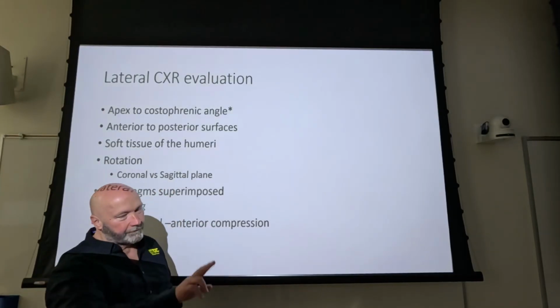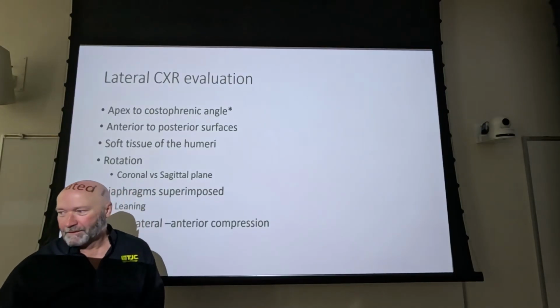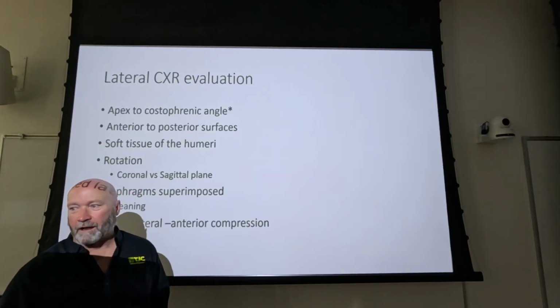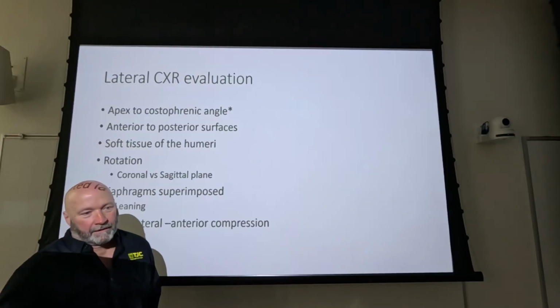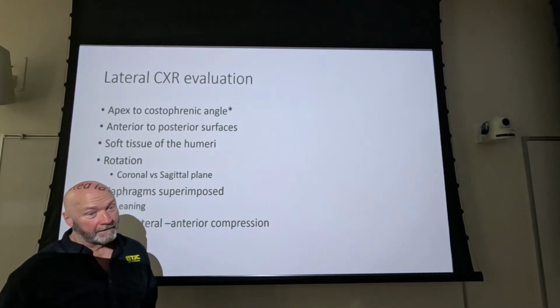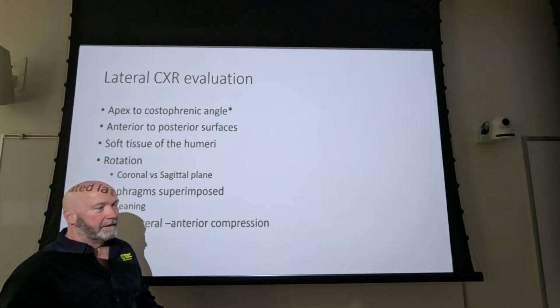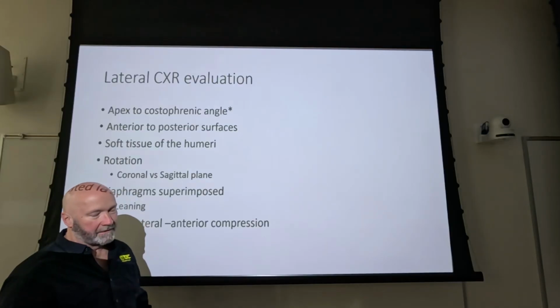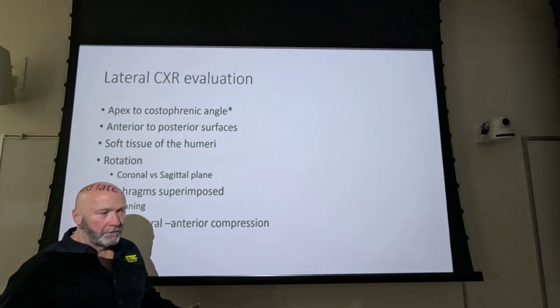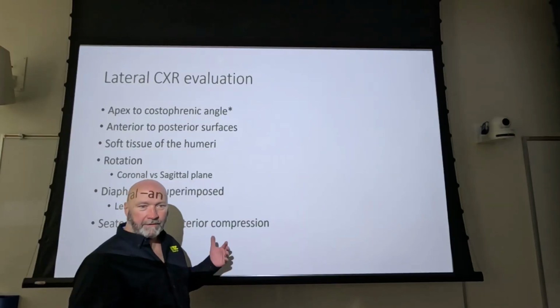You get your two fingers up there, and if it's beyond two fingers and it's not overly rotated. Two fingers is a lot, really. The positioning book says half an inch. That ain't much, so somewhere in between there is what I would settle with. Two fingers is a lot of rotation. So we tend to focus on that, but we don't really focus on the tilt.